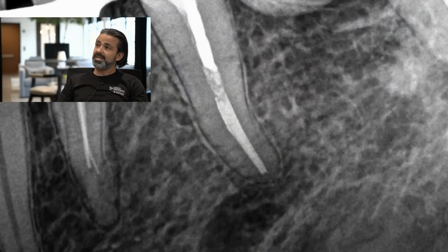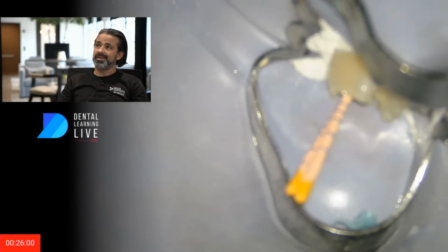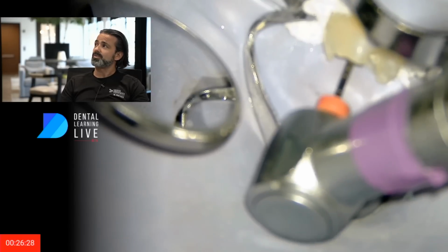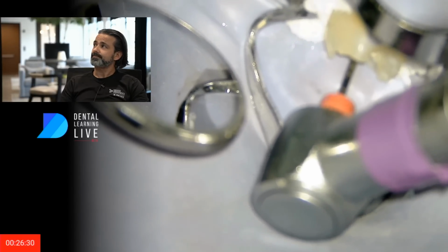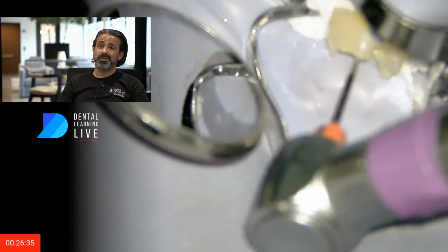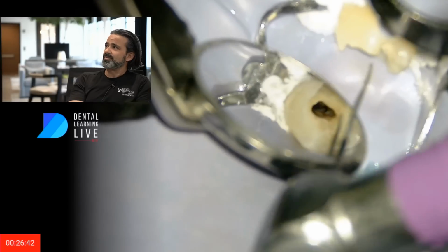So you can see I'm well past the fork and it's short. So I've got some more work to do, and that's fine. That was anticipated. Now the idea is how hard or how easy can I make up the difference and go to my corrected working length. That's what I'm doing here. And those lengths were 21 on the buccal and 20 on the lingual. I always use the reference point of the occlusal surface, just the cavosurface margin of the access.